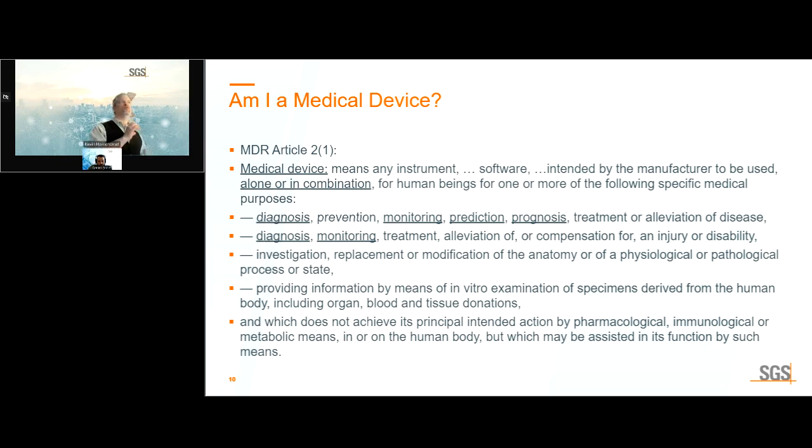Many people who use software or generate software might say to themselves, I'm not diagnosis. The doctor diagnoses. I just give him information to diagnose. I don't diagnose. The doctor diagnoses. She will do the diagnosis. But that's not true. When you look at page 43, diagnosis is defined as inclusive of information presented to the end user with which the end user will make a diagnosis.